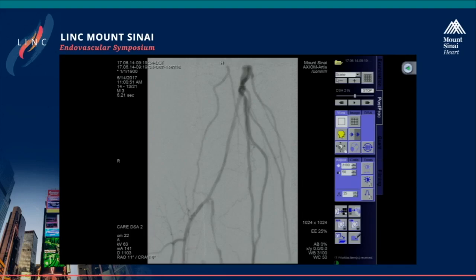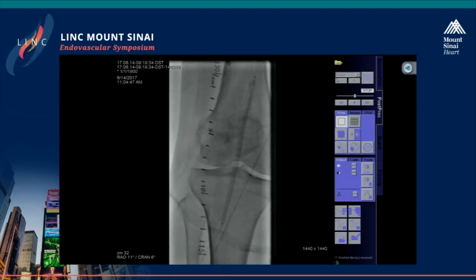So at this stage, Brian, now that we've done a chocolate, do you use this in your practice, or does the panel use this in this kind of application? And if not, which kind of application do you use this in? The chocolate balloon specifically? I don't use that, because the primary advantage in my eyes is that it allows you to do balloon angioplasty without creating dissections. And I think that's probably generally agreed upon as the main benefit. The truth is I use excisional atherectomy fairly routinely, which allows me to cut out those dissections with the device itself. So I haven't found a need for the chocolate balloon necessarily, but perhaps it's different with others on the panel here.